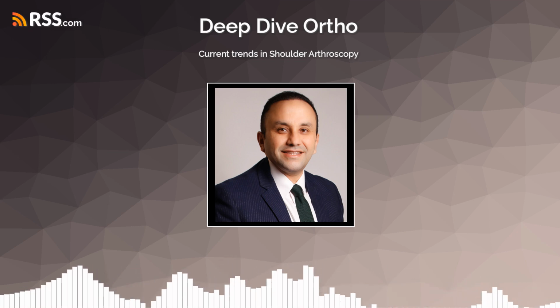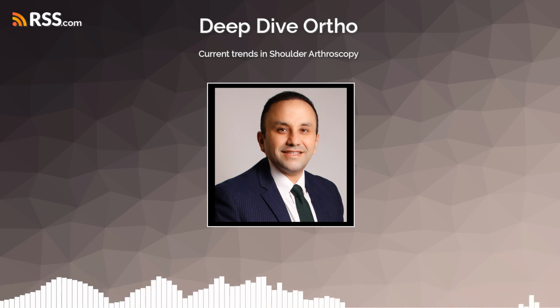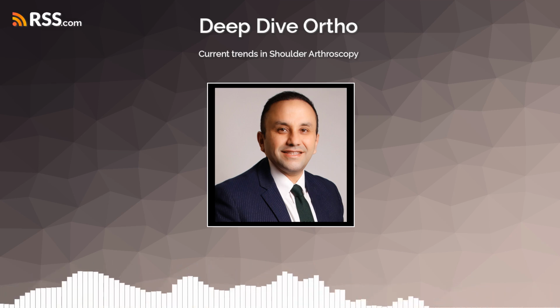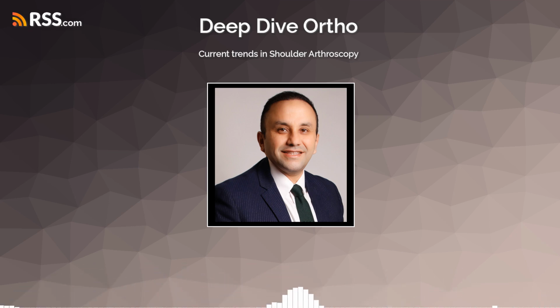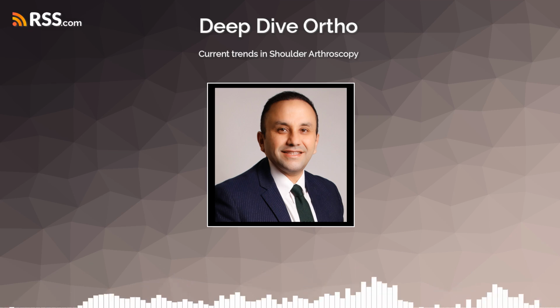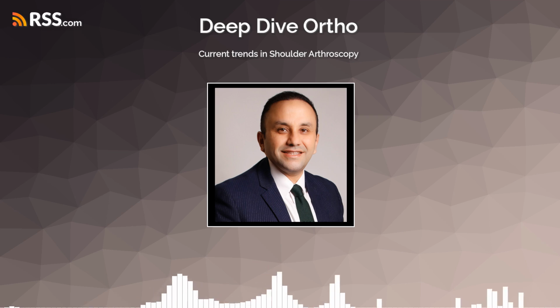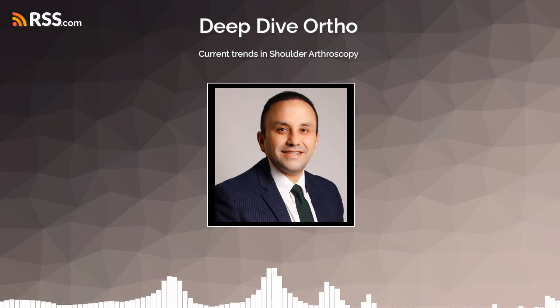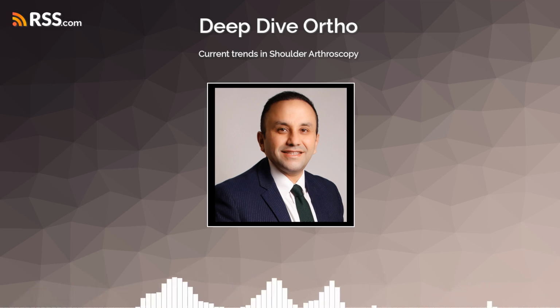When osteoarthritis in the AC joint itself becomes painful, sometimes a small piece of the end of the clavicle is removed, a distal clavicle excision. How is that done arthroscopically? Arthroscopic acromioclavicular joint resection, sometimes called a Mumford procedure arthroscopically, is a common procedure for persistent pain and sometimes instability related to ACJ osteoarthritis or impingement. What's involved? Using a small burr through arthroscopic portals, the surgeon removes a small portion, maybe 5 to 10 millimeters, of the very end of the distal clavicle.